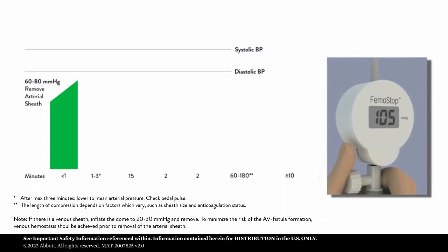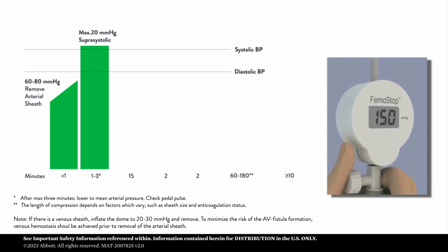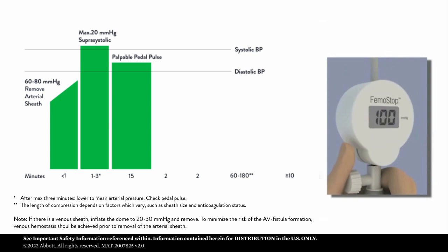As soon as the arterial sheath has been removed, continue to increase the pressure to 10 to 20 millimeters of mercury above the patient's systolic pressure. To confirm correct placement of the dome, pedal pulses should be weak or absent during the suprasystolic phase. Maintain this pressure for 1 to 3 minutes. Do not leave the artery blocked for more than 3 minutes to prevent limb ischemia. Lower the pressure to mean arterial pressure by opening the valve until limb perfusion is restored. Monitor the incision site to make sure that hemostasis is maintained. Check again for pedal pulses. When reducing pressure, avoid releasing pressure too quickly to reduce the risk of dislodging thrombotic material in the artery.